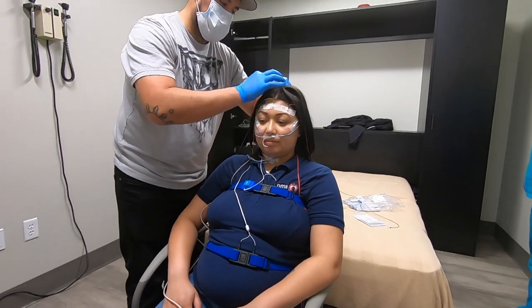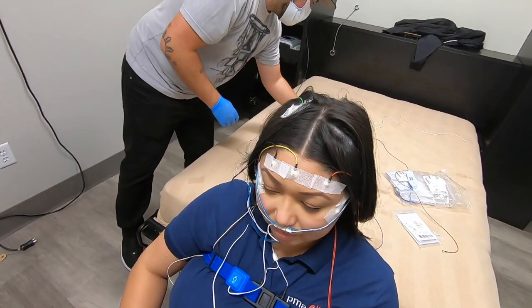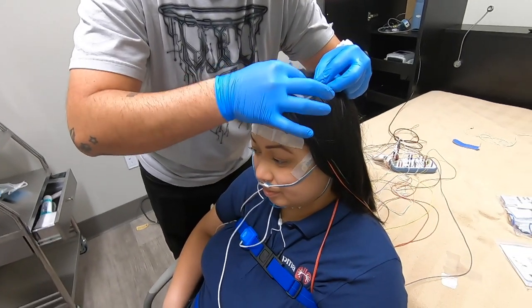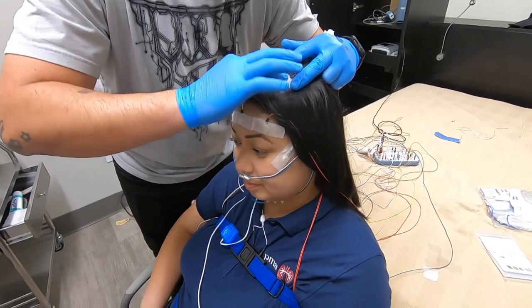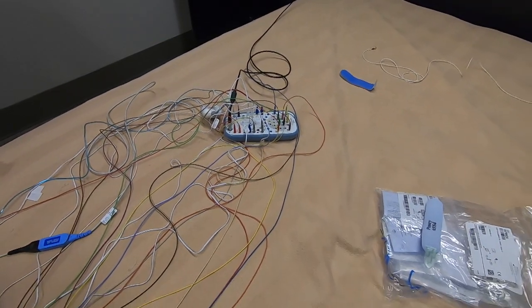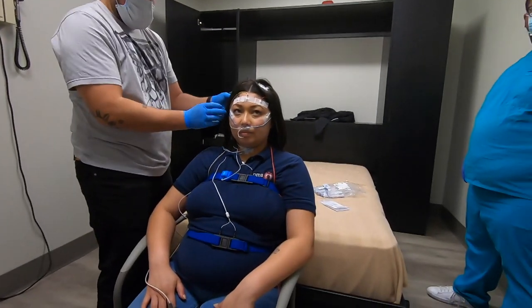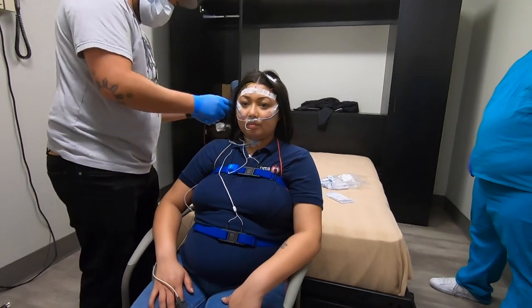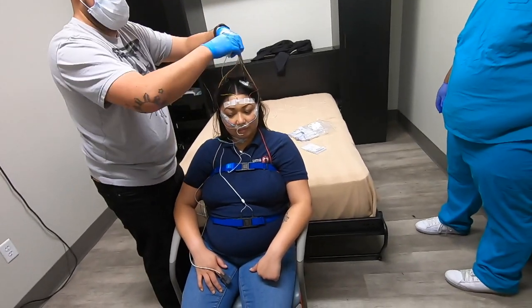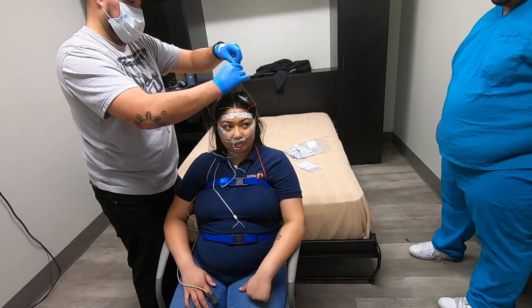Now they're putting electrodes on the head in the center — roughly 45 degrees down, right there. Those pick up brain activity as well, slightly attenuated from what the frontal channels do. The other two you won't be able to see are down around the back of the head, about where the bottom of a baseball hat sits, right on the little knob that sticks out on the back of your head. There are also two electrodes behind the ear used as reference points — a stable location where the F channels, C channels, and occipital channels can all have a reference point for those signals.